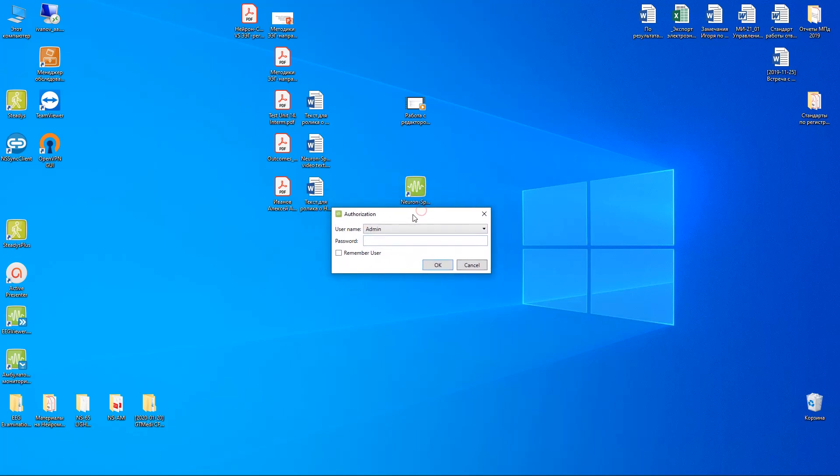Here is the authorization window, where you can select the username and enter the password if it is necessary.